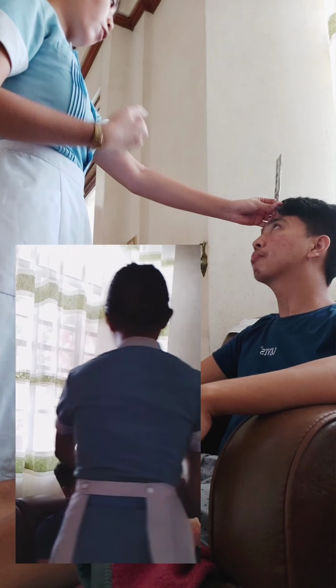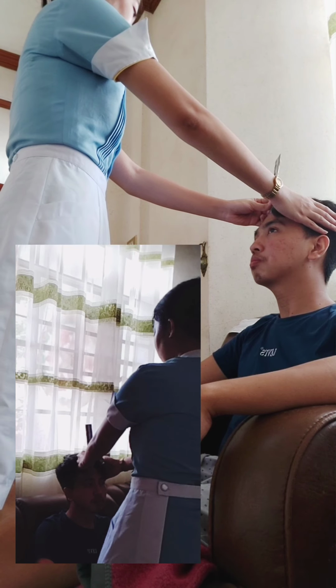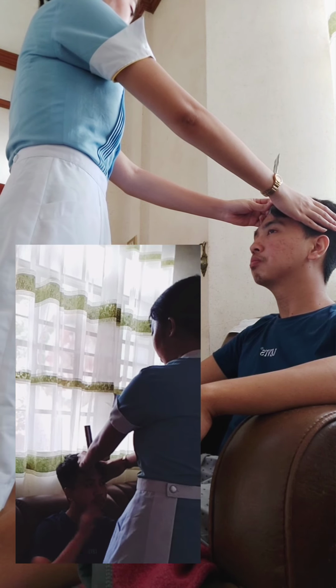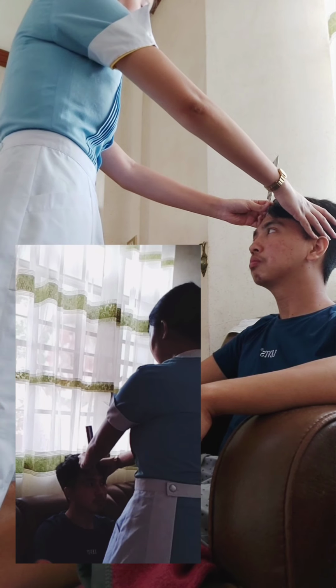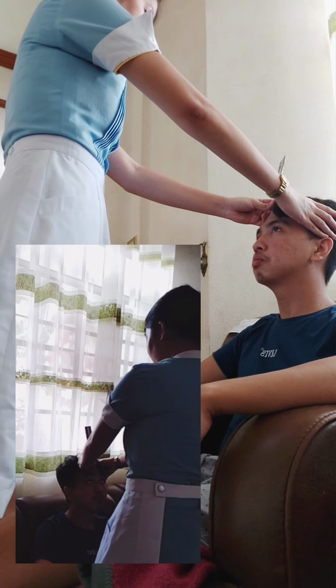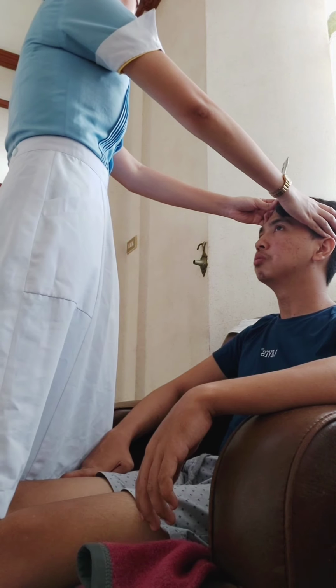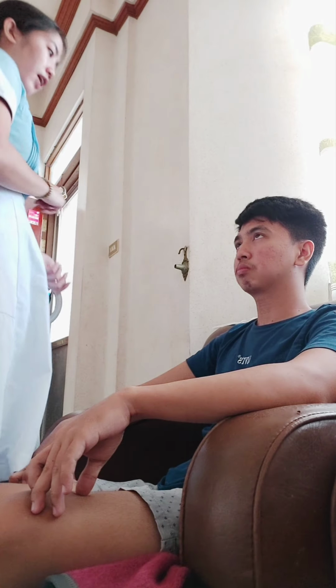Then it is important to steady the patient's head with your other hand so that reasonably firm pressure can be applied. Now I will ask the patient, sir, do you hear the sound louder in one ear than the other? No. Okay.